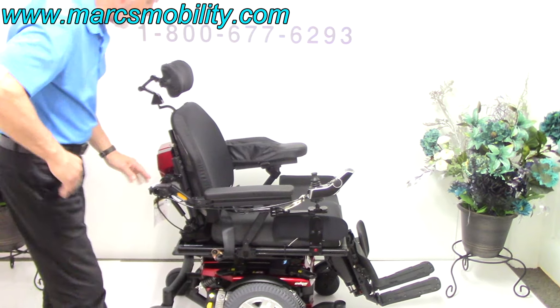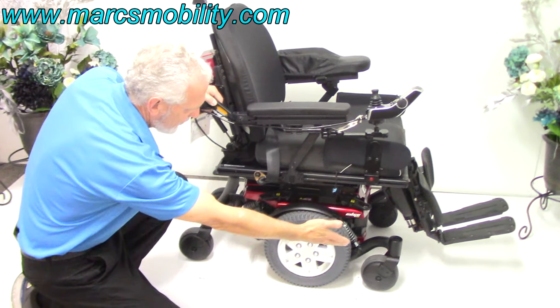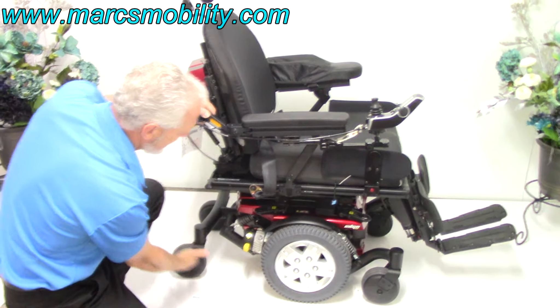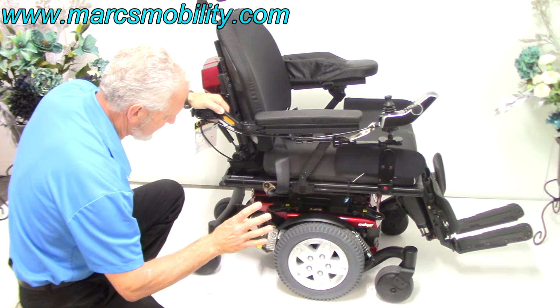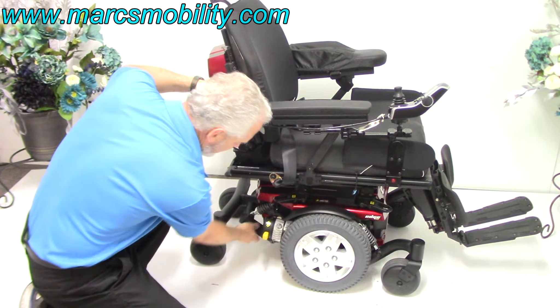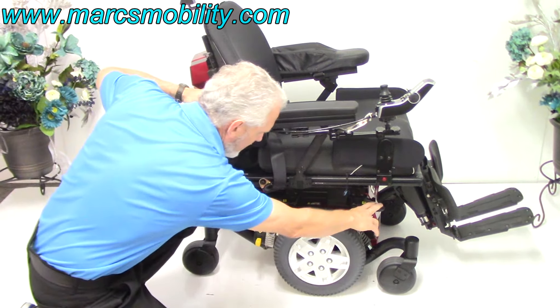Let's talk about the base. You've got 14-inch solid wheels, castor wheels in the front, and castor wheels in the back. There's suspension on both sides — four shocks of suspension with this chair. You've got a bigger frame for this heavy-duty model.